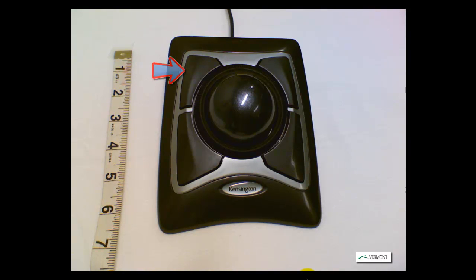Over here we could also assign double click to this particular button area if a person has difficulty double clicking, such as launching a program icon on the desktop of the computer, or other tasks that require accurate double clicking of a mouse button. Any of these buttons or all of these buttons can be reassigned unique mouse functions using Kensington software called Trackball Works, as seen later in this video.